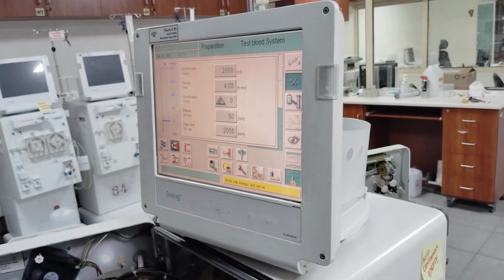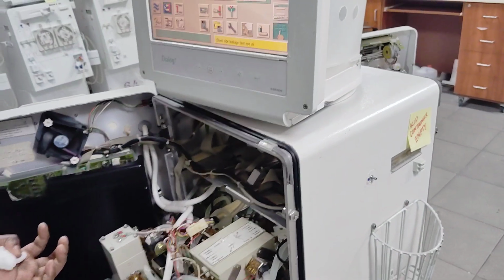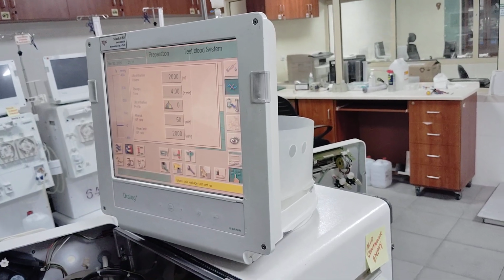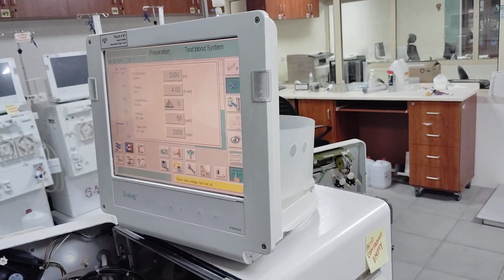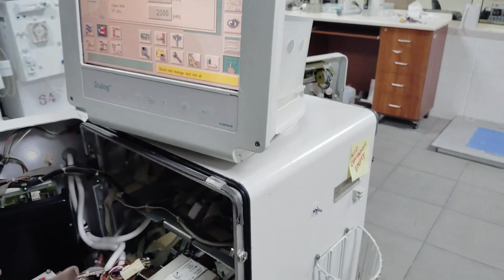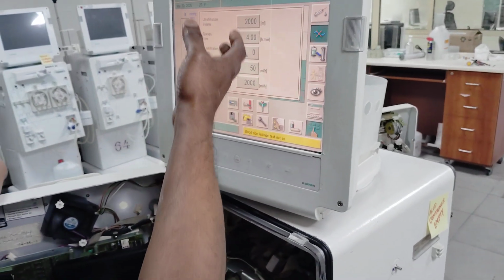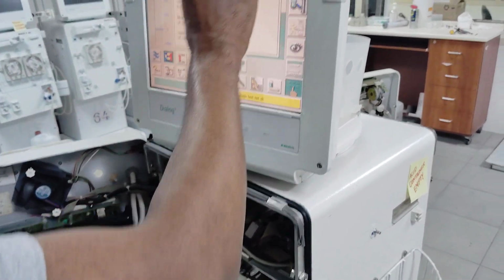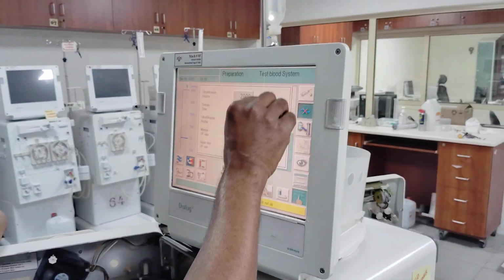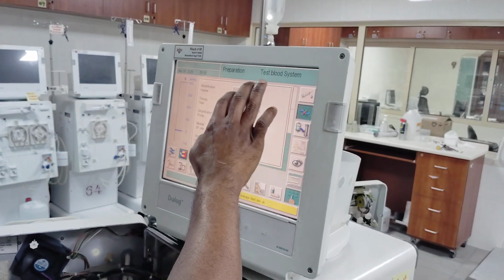Okay. So whatever they drink, eat, like urine. Normally, when patients are in good health and the kidney is good, urine itself is ultrafiltration. Your kidney will do the function normally. But if the kidney is damaged, that's why they are trying to do dialysis over here, because the kidney can't remove the excess fluid in your body. For that case they will set ultrafiltration, how many ml they have to remove from the body. As per the doctor's order they will feed it over here. It's not our part, it is for clinical staff. So they will feed it over there.